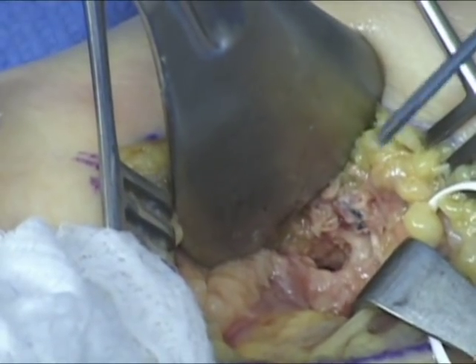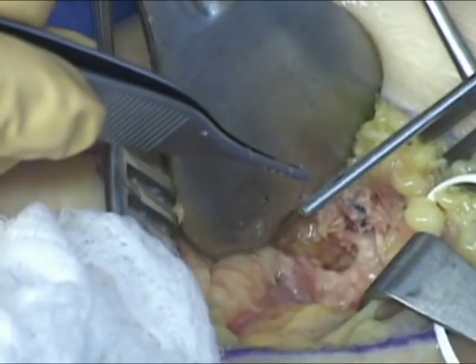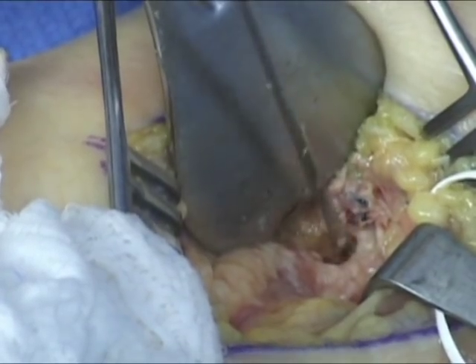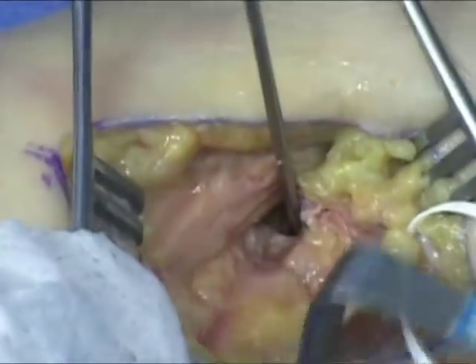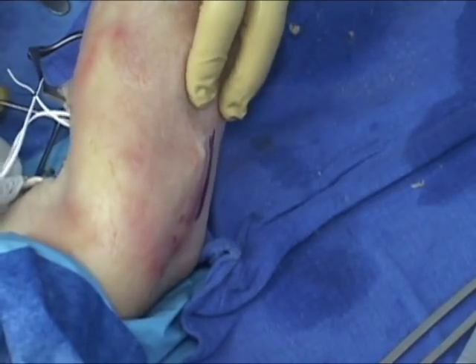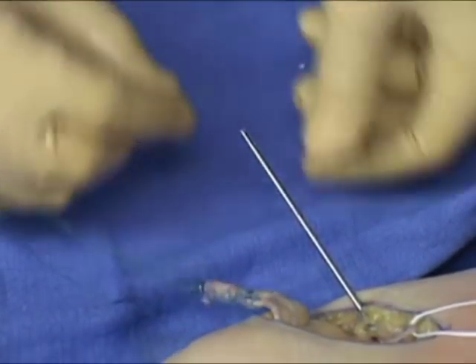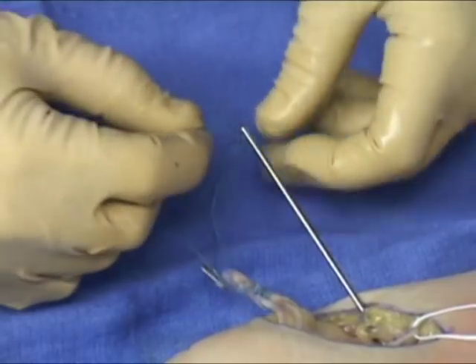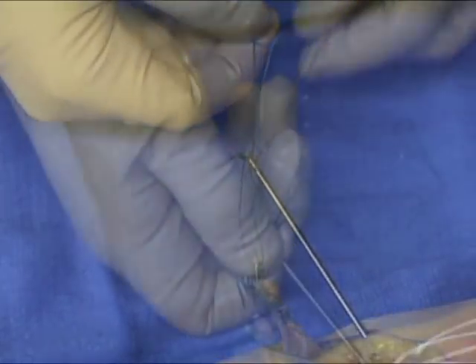The cannulated guide wire is then inspected. Its distal end has a slot for passage of both looped marionette sutures. The guide wire can then be bluntly passed through both the anterior and posterior holes drilled in the radius. With the arm held in full supination, all retractors are removed, the elbow is flexed, and the wire bluntly advanced to exit subcutaneously 1 cm ulnar to the subcutaneous border of the ulna. It is partially drawn through the skin leaving sufficient wire anteriorly to retrieve the marionette sutures. Both suture loops are then passed through the cannulated drill slot in preparation for biceps tendon passage, and the guide wire and loop sutures are pulled through.